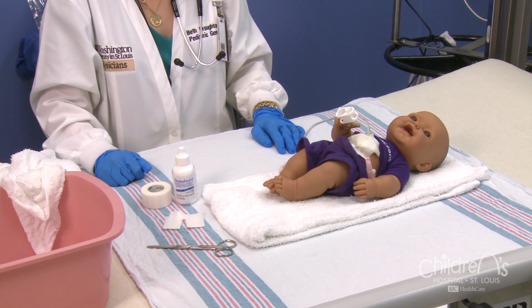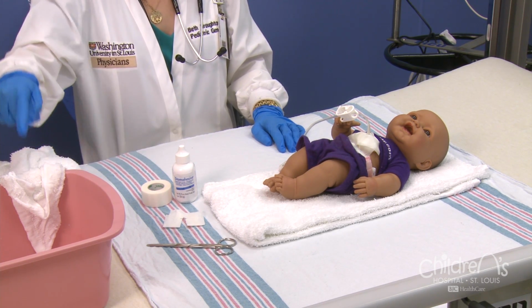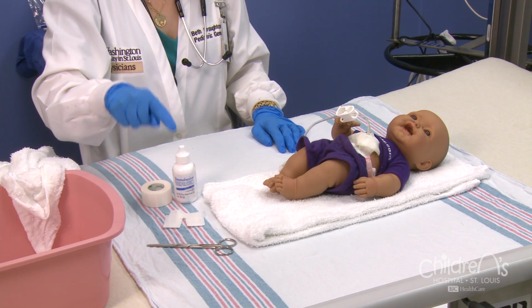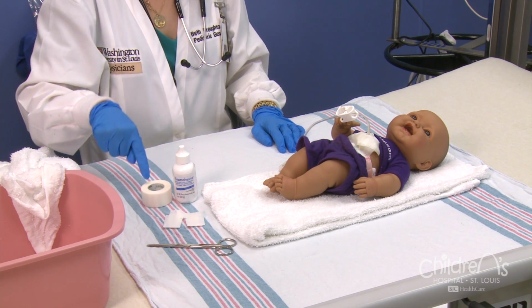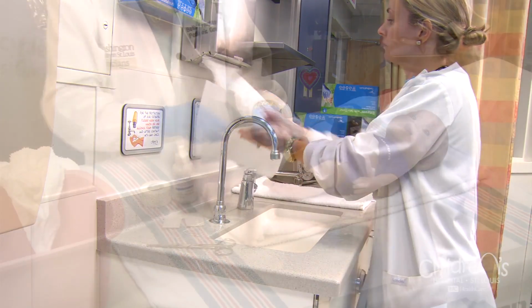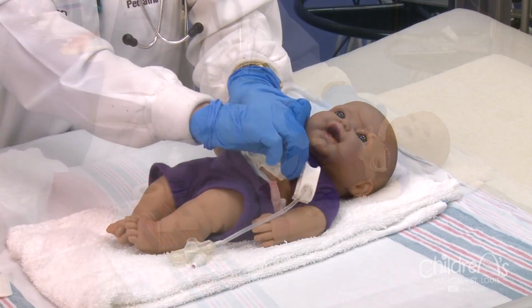When done properly, the dressing will also help secure the device and help keep the skin around your child's insertion site healthy and comfortable. If your child's appliance is a tube with a disc, you'll need the following supplies to change the dressing: a washcloth or Q-tip, soap and water, stomahesive powder, split 2x2 gauze, tape, and scissors. Once you have gathered your supplies, wash your hands. Then remove the tape on the silicone ring and take out the old gauze.